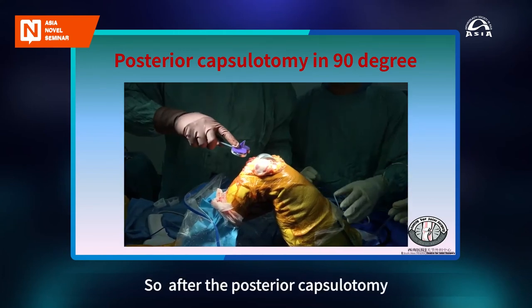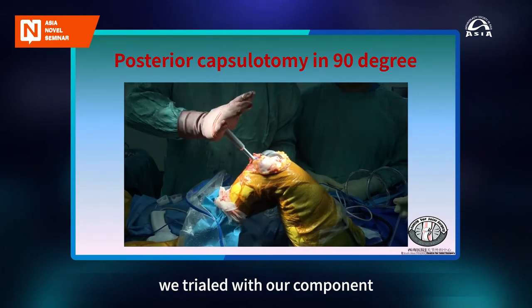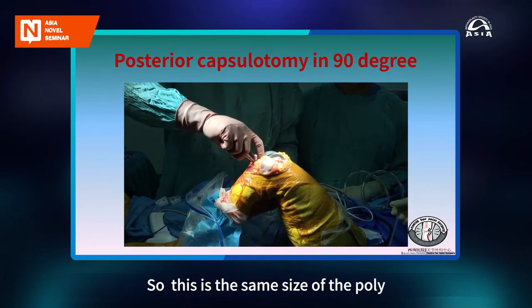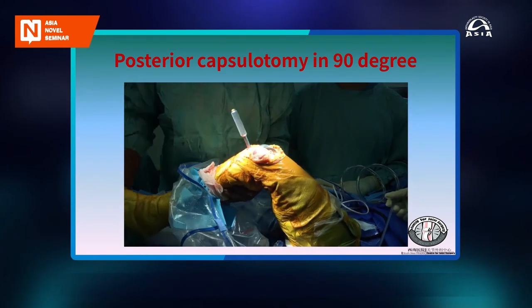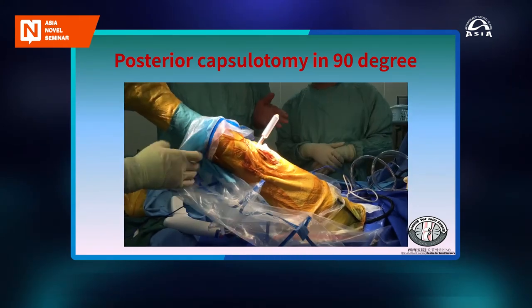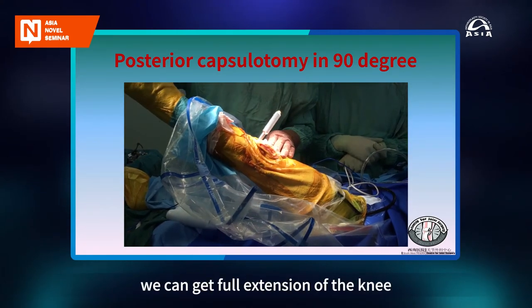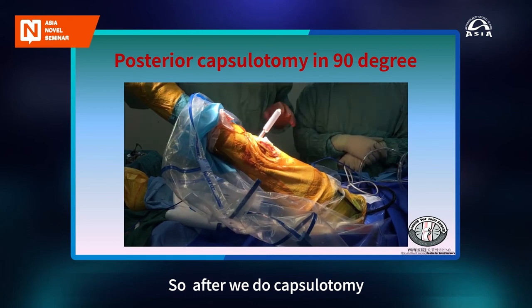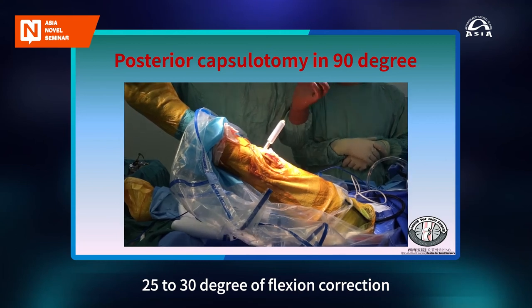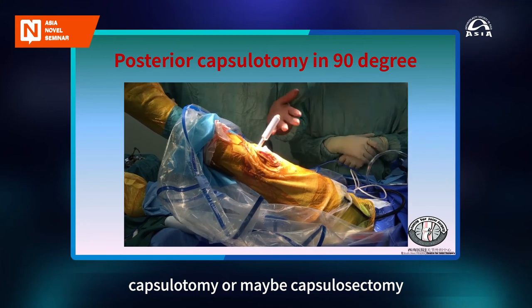So after the posterior capsulotomy, we trial with our component to see if we can get full extension. So this is the same size of the poly. And very easily we can get full extension of the knee. So after we do capsulotomy, I think we can get about 25 to 30 degrees of flexion correction. So what's your opinion about capsulotomy or maybe capsulectomy?